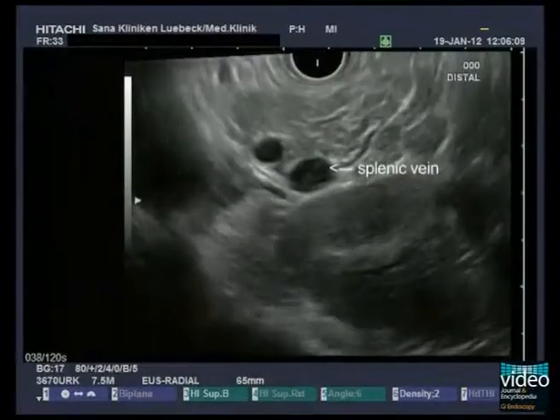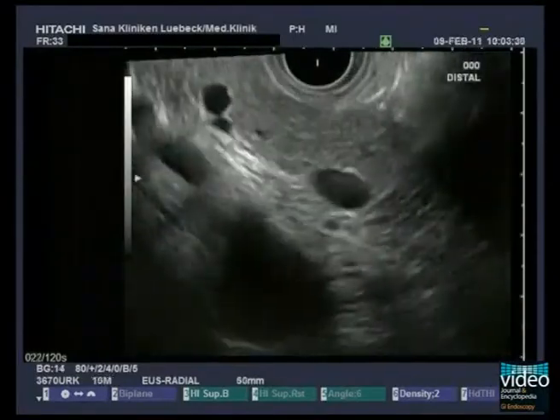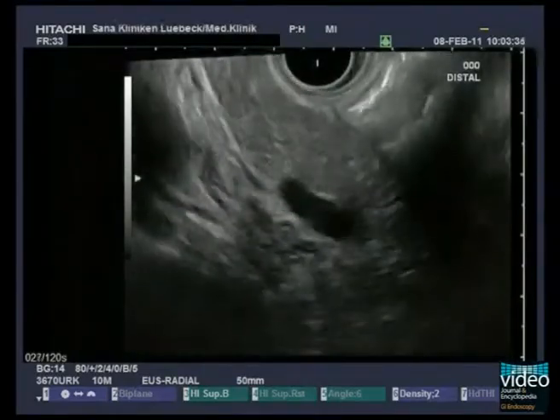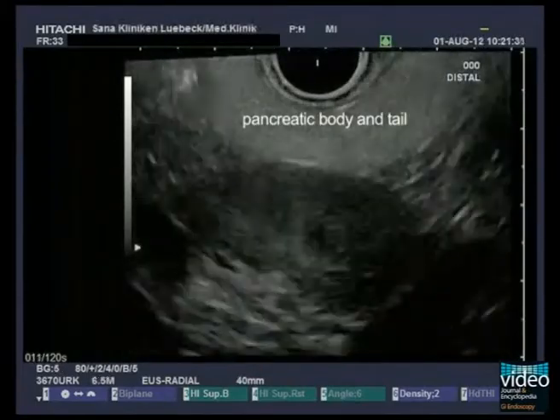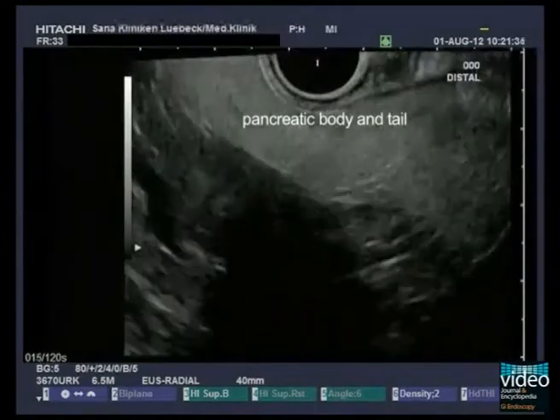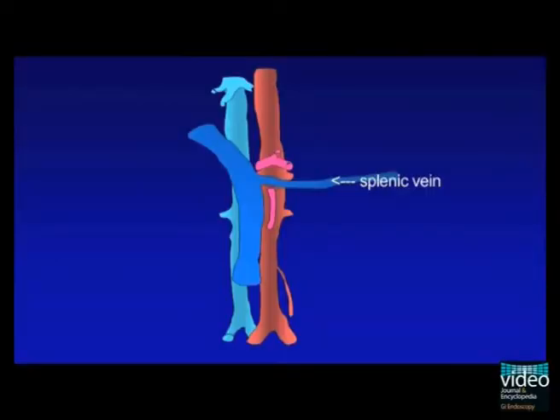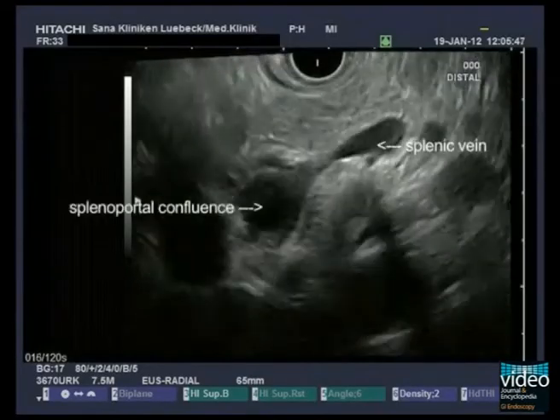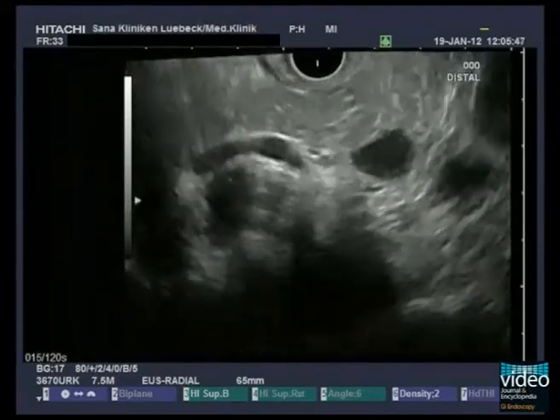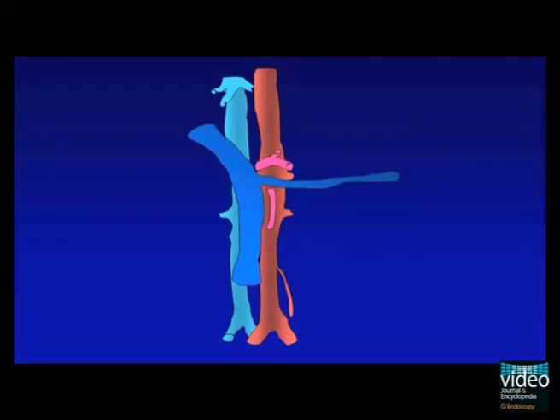The splenic artery and the more caudally located splenic vein can be followed by withdrawal and rotation to the left into the splenic hilum. These vessels provide good orientation for the examination of the pancreatic tail and body. Once you have identified the splenic vein, it is easy to follow the vein into the splenoportal confluence by a careful rotation to the left. The superior mesenteric vein reaches the confluence caudally; therefore, you have to push the instrument downwards over the level of the confluence.